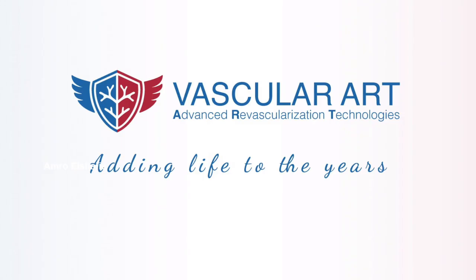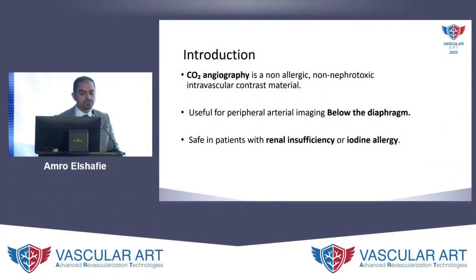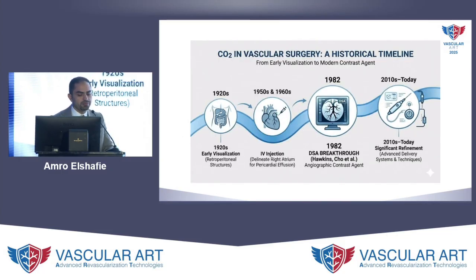As we all know, CO2 angiography uses a non-allergic, non-nephrotoxic intravascular contrast material for peripheral arterial imaging below the diaphragm, and it is safe in patients with renal insufficiency or iodine allergy.